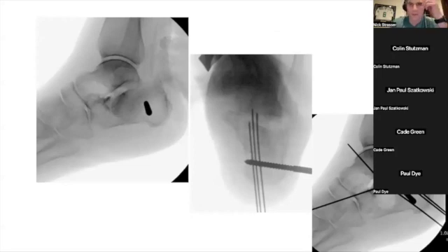I probably wasn't as aggressive maybe, but then I try to put the K-wires in. You probably want two K-wires in this case to preload them into the tuberosity, pull it out of varus, and then run them up into the medial side. I try to preload it - easier said than done - but I like putting them in the heel because once you get it, fire the K-wires across to hold your reduction.